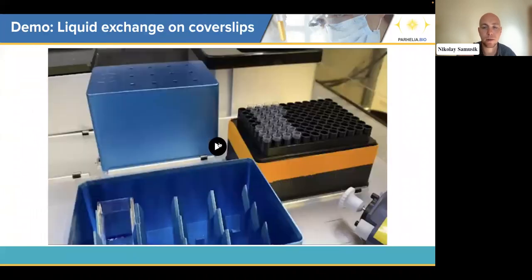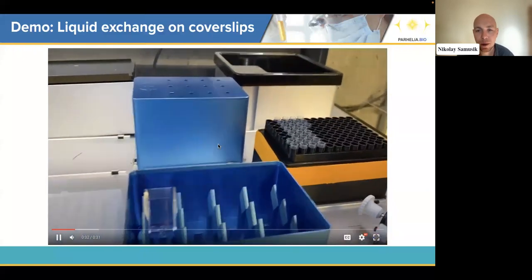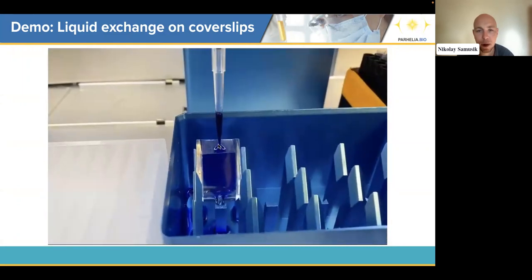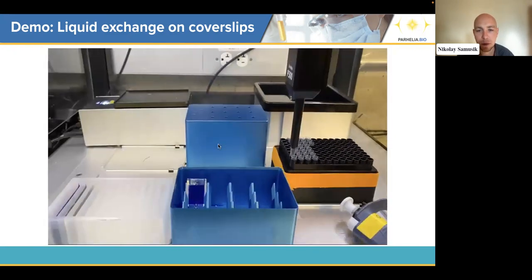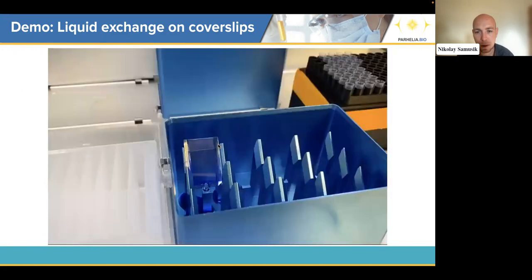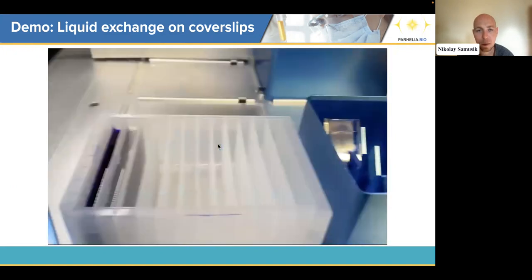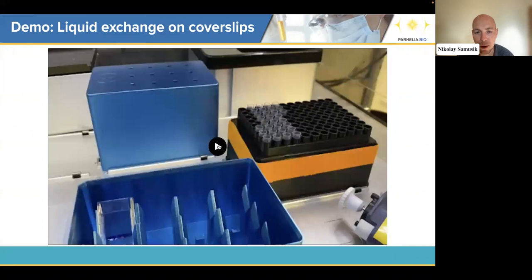So this is actually Omni-Stainer sitting inside Opentrons. And you can see the robot picking up the pipette and going to a 12-well trough reservoir and picking up liquid, the blue dye, and then dispensing that liquid into the cover slip, which sits on top of the support tile. And now, with a couple of washes, it gets all the blue liquid out of the chamber. And you can see the waste collecting at the bottom.